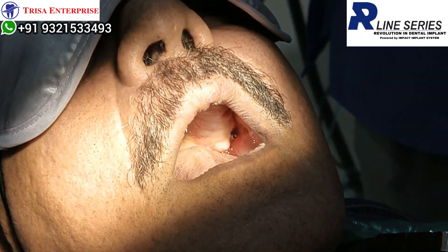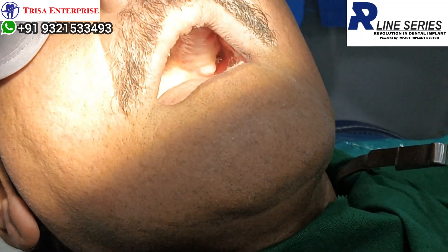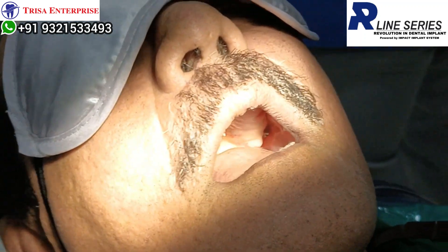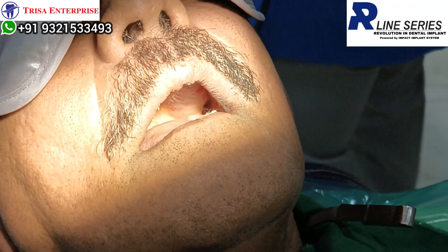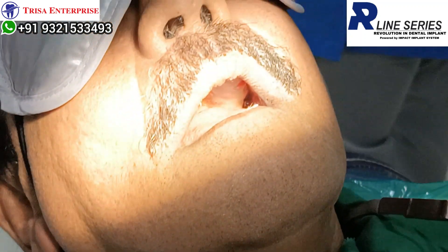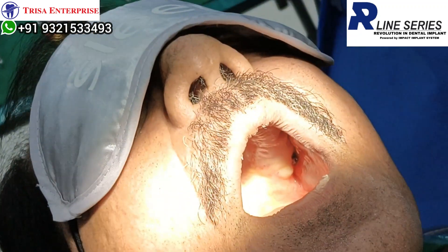Let me see if I can get one more pterygoid implant in, or we can get a sinus implant 5.5 next to it. I have placed the pterygoid. Now, referring to the OPG, I am going roughly in the area of the 6 palatal root for my 5.5 implant — that is the plan. Either 5.5 or, if bone quality is good, I will be using a QS implant 4.6.